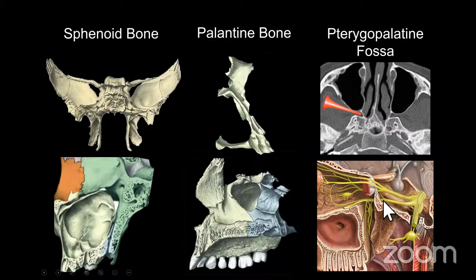We can see this nerve is V2. This runs through foramen rotundum, which is going anterior to posterior. And it runs through the roof of the pterygopalatine fossa and then through the inferior orbital fissure and runs along the floor of the orbit. And then we can see V1. V1 runs along the roof of the orbit itself. So that's our regular anatomy here of that central skull base.